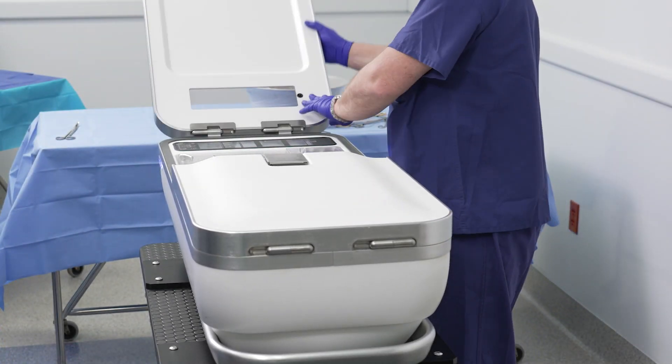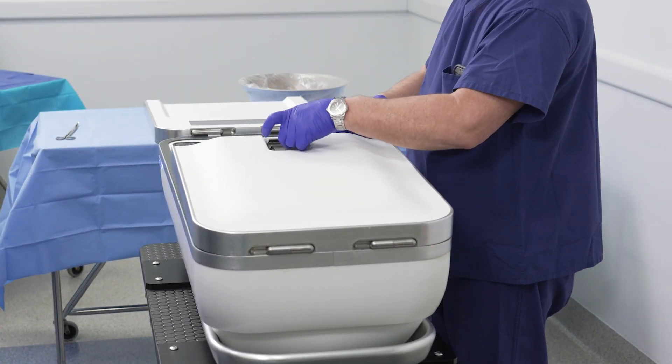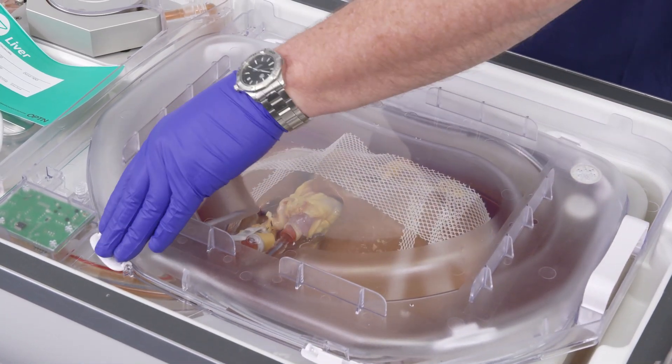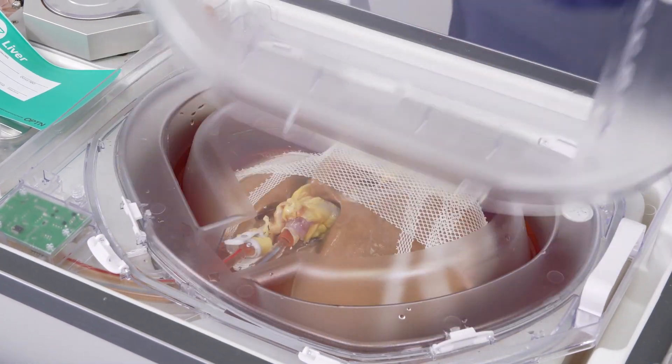Unlatch and open or remove Lifeport liver transporter covers. Remove the outer perfusion circuit lid and place it upside down on a table where it will be undisturbed.